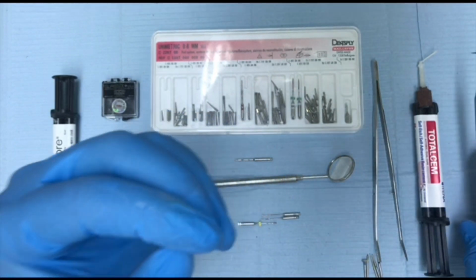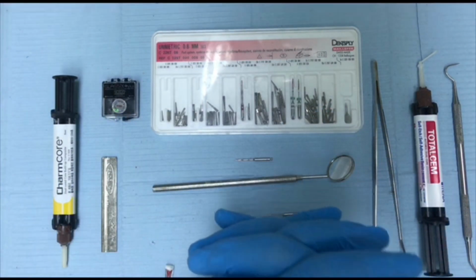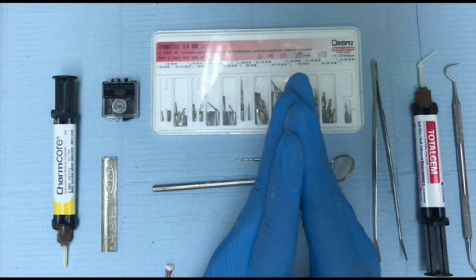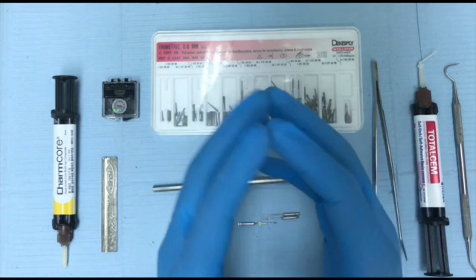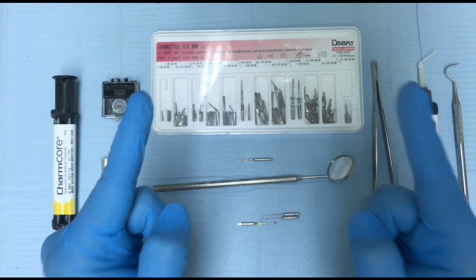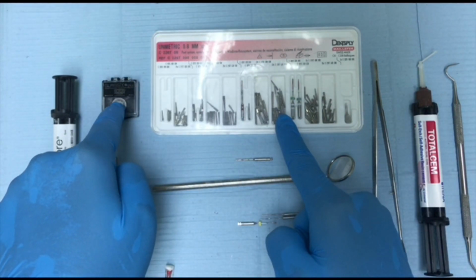Now we can get a closer look at the post kits that we have, but before I show you the kits, you have to understand that the posts are classified according to the method of construction into ready-made posts and custom-made posts. And ready-made posts are further classified according to the materials into metal posts and fiber posts.